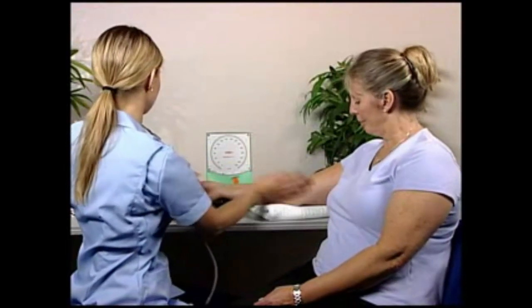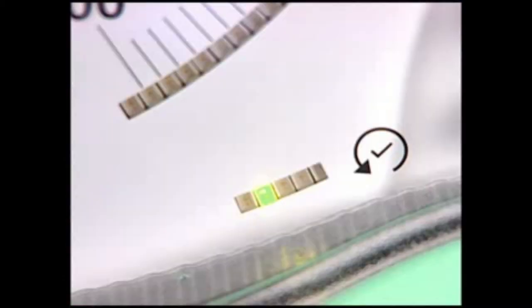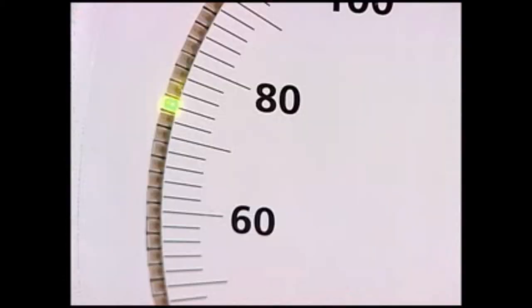Blood pressure is measured using the same manual technique as with a traditional mercury or aneroid device. However, the GreenLight 300 also has a number of additional features to assist you in taking accurate measurements.